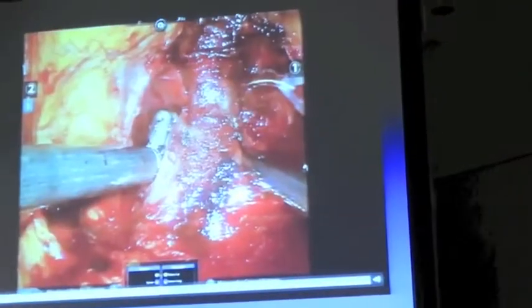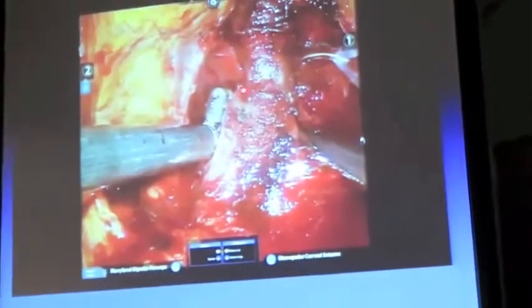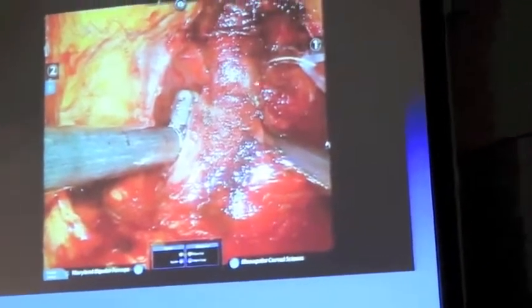Okay, I will show you another example of one of my cases. And you were looking at it from the side, and then you went back to this side now. There you go. Could you please join me? How many of you, please raise your hands, will cut the urethra? You see the prostate is here, up to here. We'll cut the urethra from here.